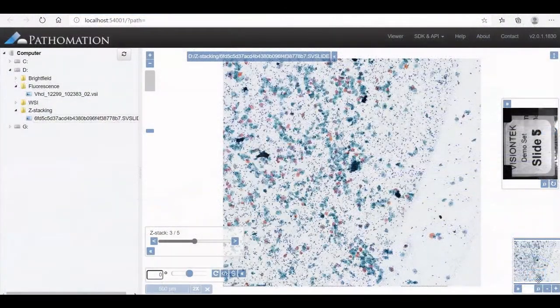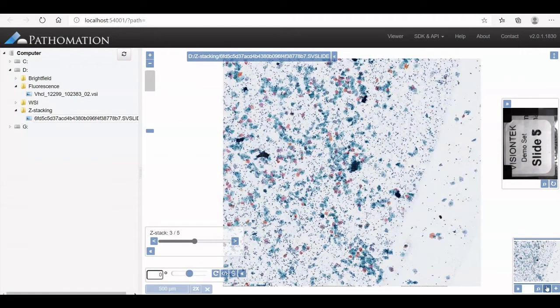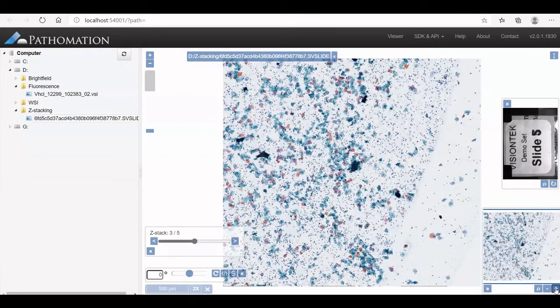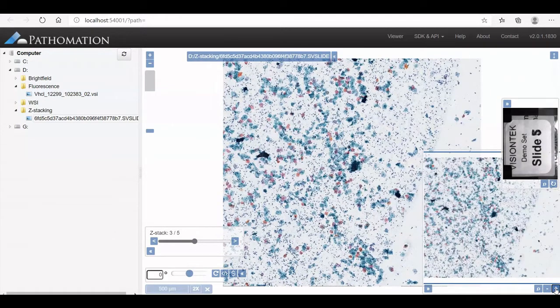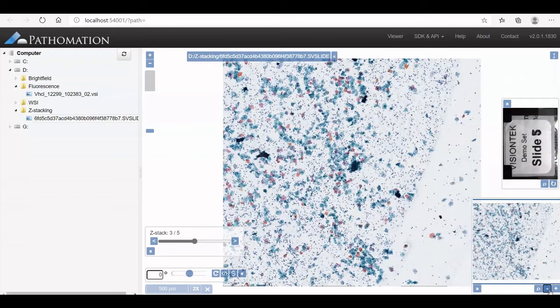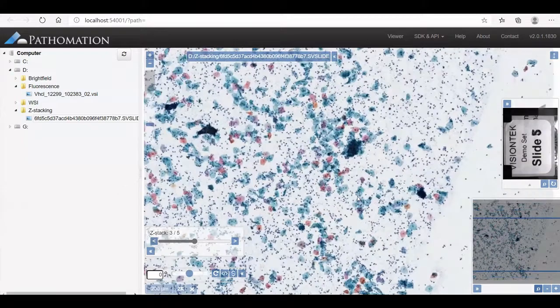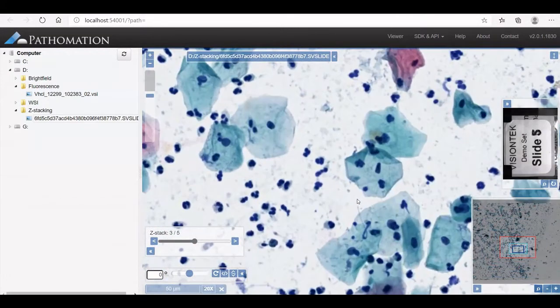You have probably already noticed this small panel on the right. This gives you an overview of the slide. You can choose to make it smaller or bigger. This panel also has the amazing feature to enable tracking on your slide, so you can be sure you did not miss a spot.